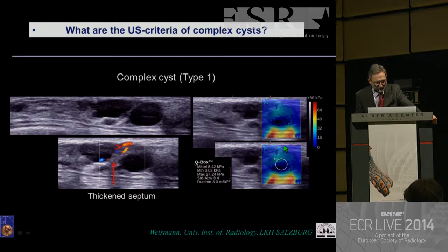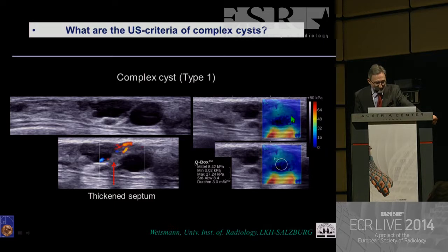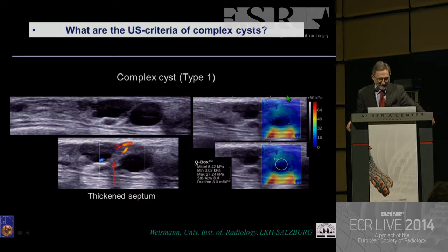If you go for shear wave elastography, you can see that some parts in the elastography don't show any signal — very low kilopascal values. And in the surrounding area, you can find a higher-hardness part of the tissue.